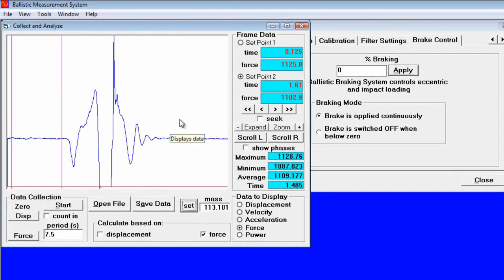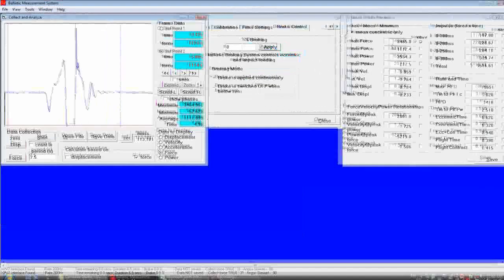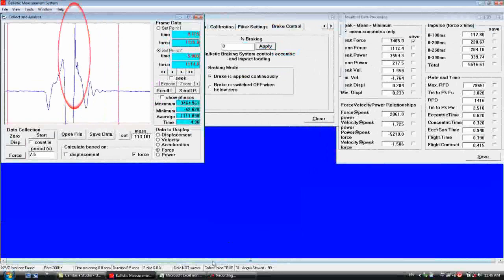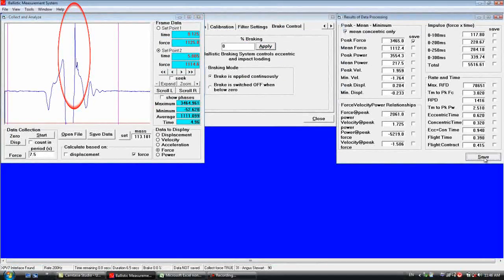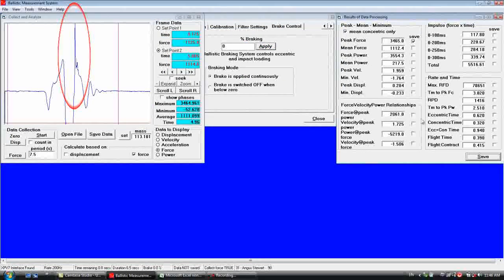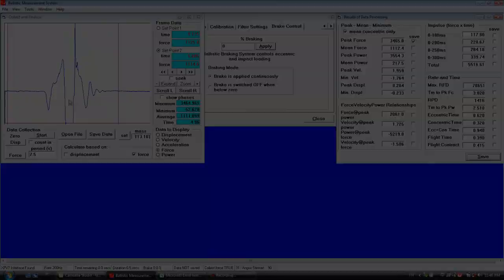We can then move set point 2 to the other side of the jump. This will give us our peak force, which is the spike from landing. We can save that data to an Excel file.